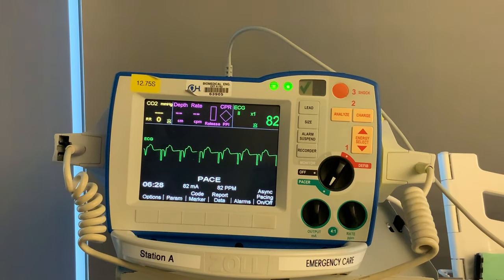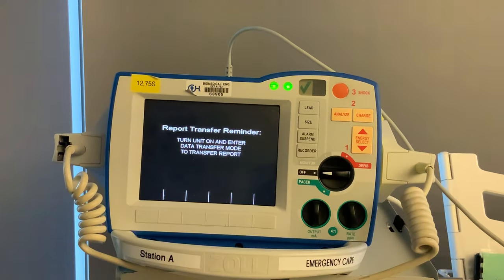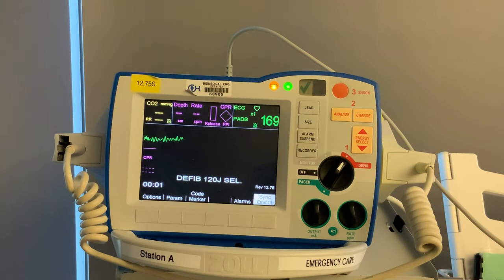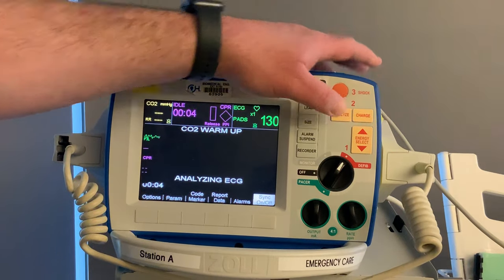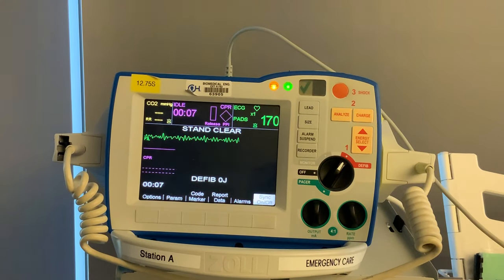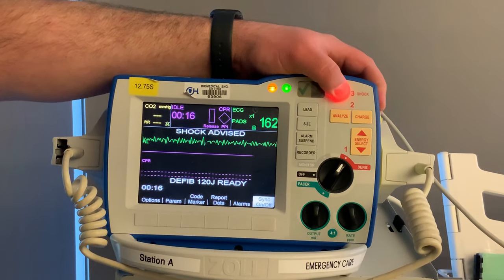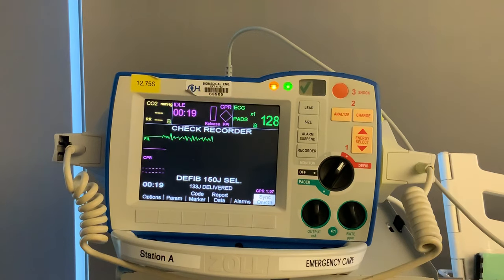Those are the basic functions of the Zoll R Series defibrillator. One other thing to show you is the analyze button. If a patient goes down and you don't have a frontline provider there, you can use this defibrillator as an AED. Turn it all the way over to defibrillator mode and hit that analyze button. It's going to analyze the rhythm. If it's a shockable rhythm, it will charge up, and then you have to hit the shock button — I'm clear, you're clear, oxygen clear — and shock the patient. It will then tell you the next steps.